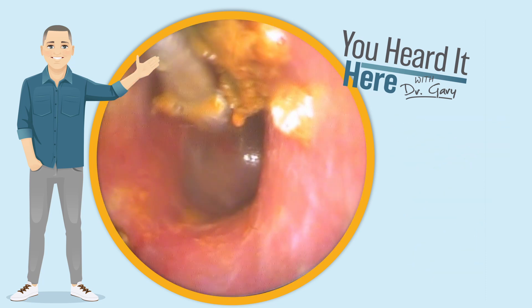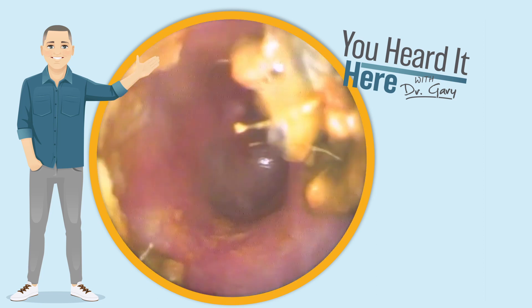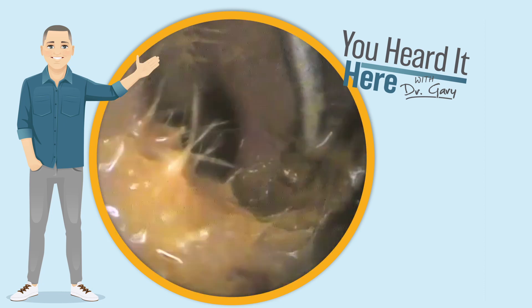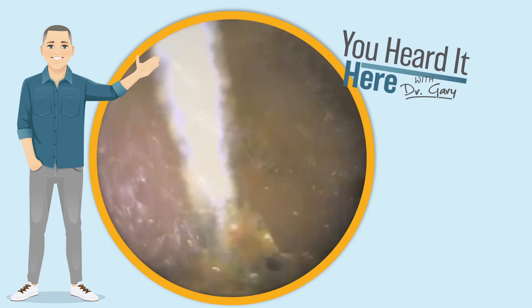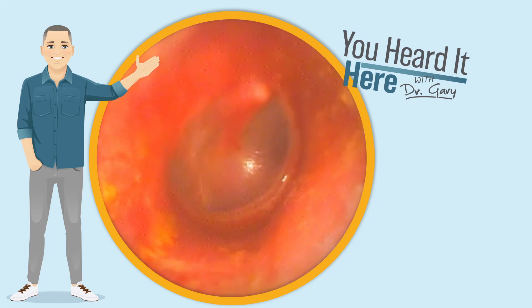All right, we're just about done. We're going to use the curette to get this last little bit of wax out of the ear. That's a pretty good view of the eardrum — there's still a little bit here at the outside we're going to need to clean up though. And that's a wonderful view of the eardrum there.